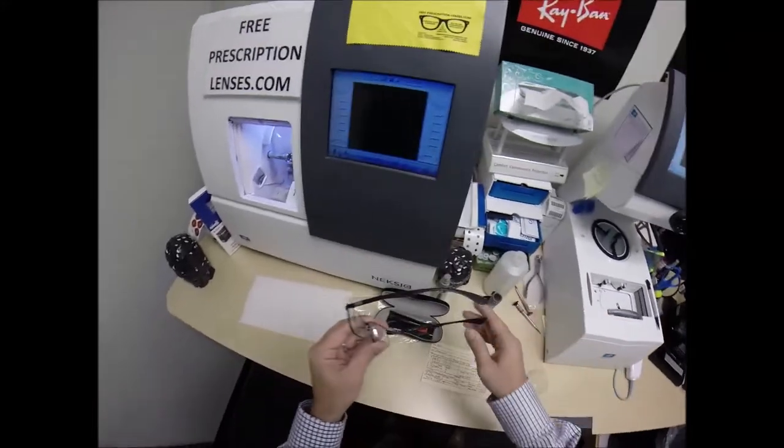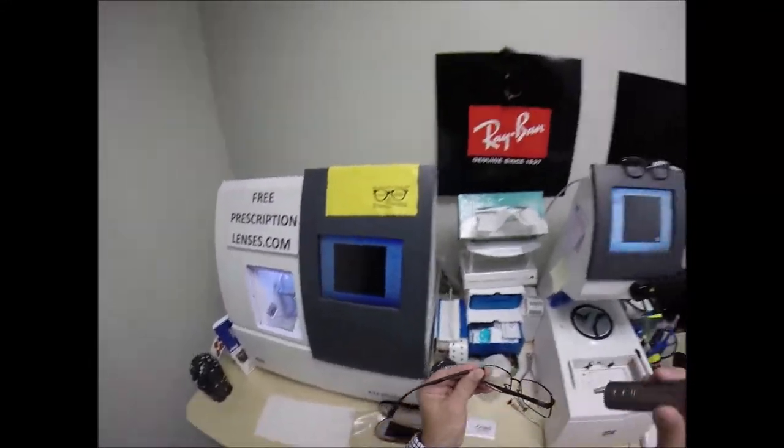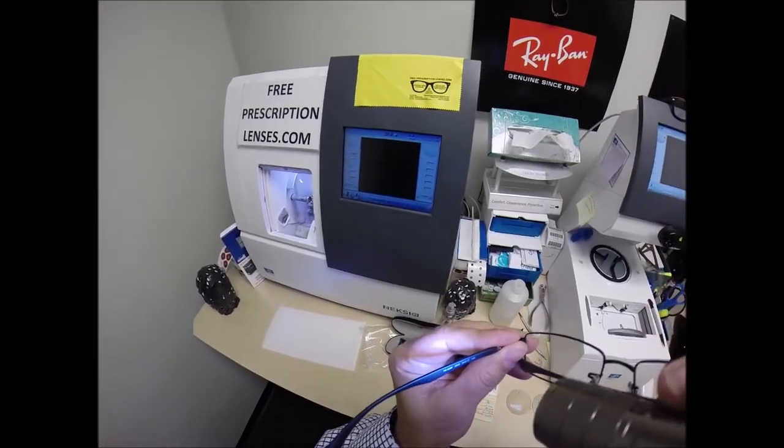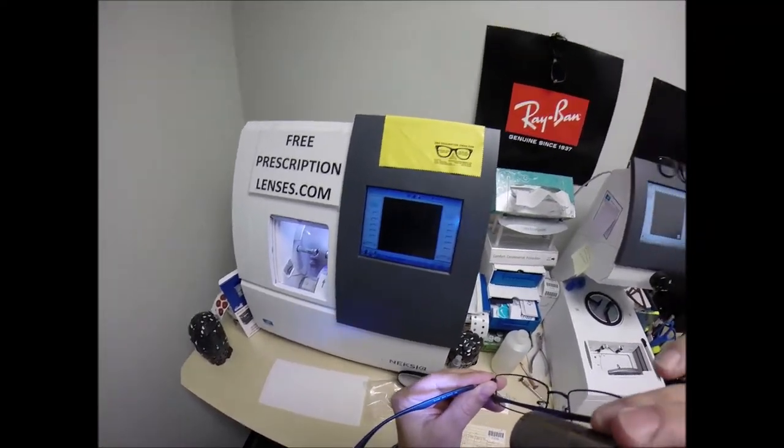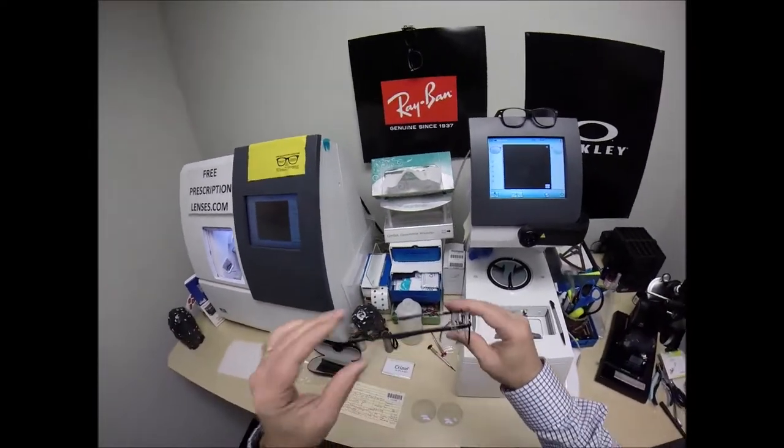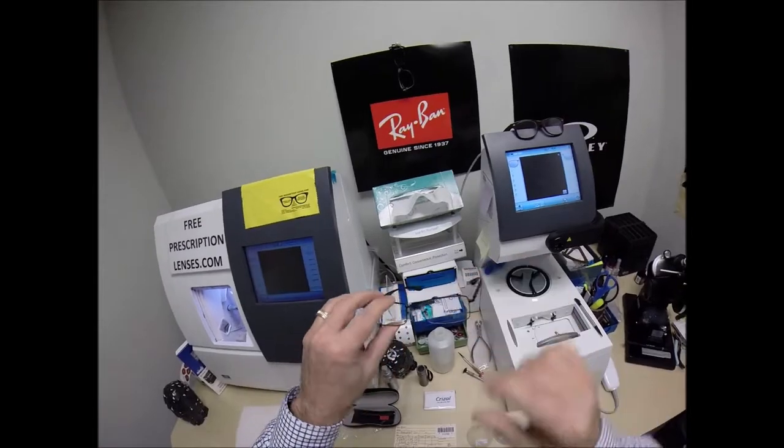Of course it comes with a little plastic sleeve on the left temple to protect the temples from rubbing together during shipping. This is the Ray-Ban Light Force made in Italy. This is the Ray-Ban 6286, color 2509, which is the matte black in the 54 eye size. I believe this frame comes in two sizes and several colors, but super lightweight frame. Again, that's why it's part of the Light Force series.